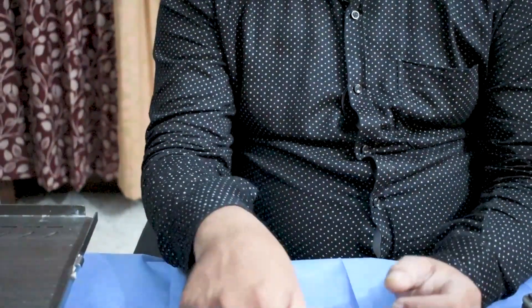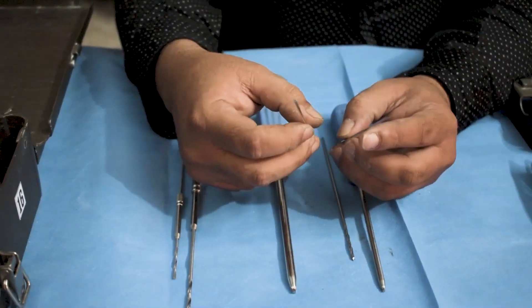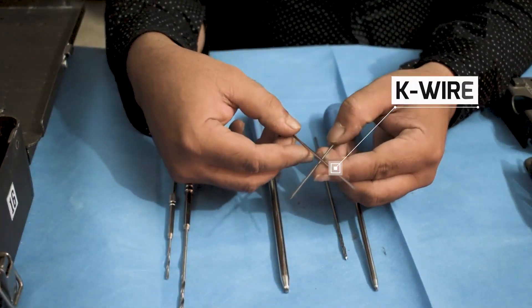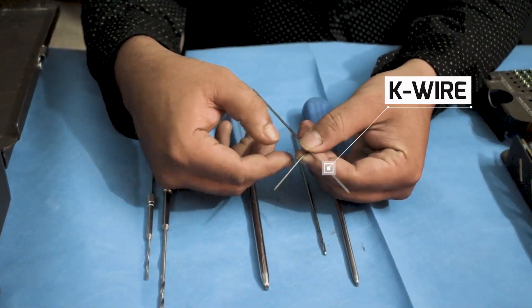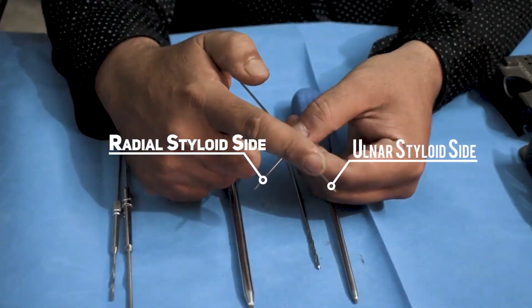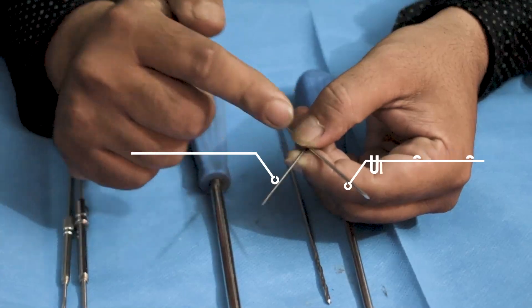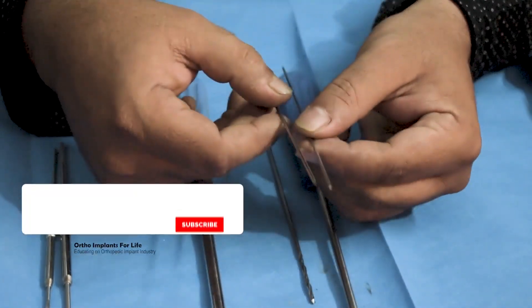In case of a Colles fracture in the distal radius, the doctor can fix the fracture using two K-wires from two directions — one from the radial styloid side and one from the ulnar styloid side. It is totally the surgeon's call how to fix the fracture.